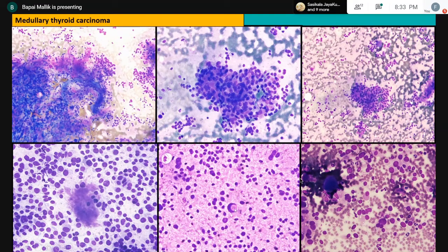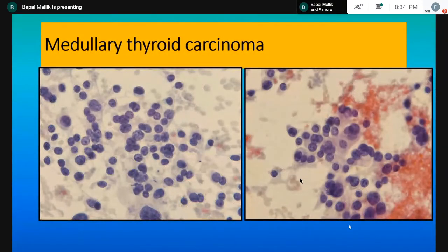And you see the cell with an intranuclear inclusion. This here would be your so-called classic, your all-time favorite plasmacytoid cells. We like to see plasmacytoid cells because they're easy to identify. And we know that when you see a thyroid aspirate and you see plasmacytoid cells, you don't miss medullary thyroid carcinomas. We know, okay, we are dealing with a medullary thyroid carcinoma. Of course, there are exceptions. So we like to see plasmacytoid cells. But here is the map.